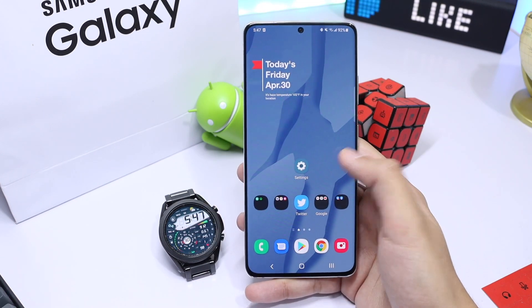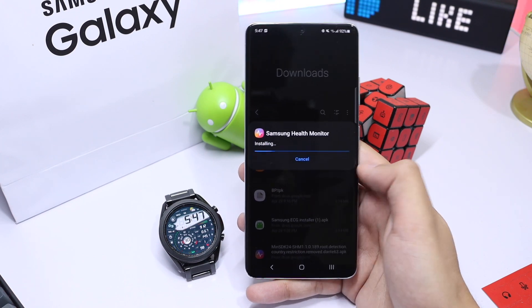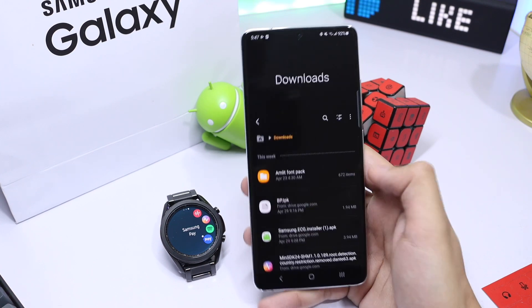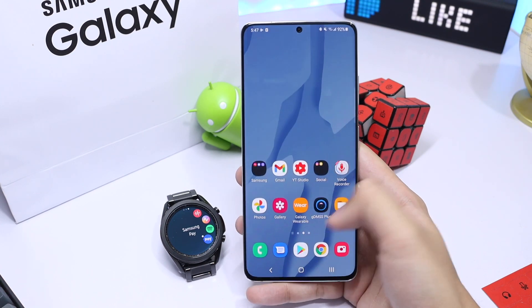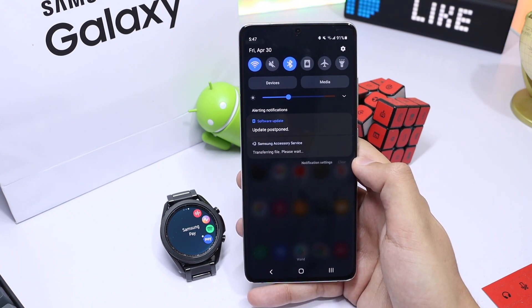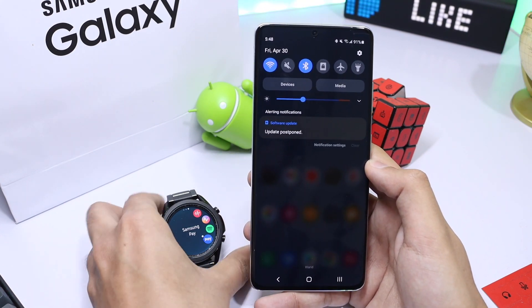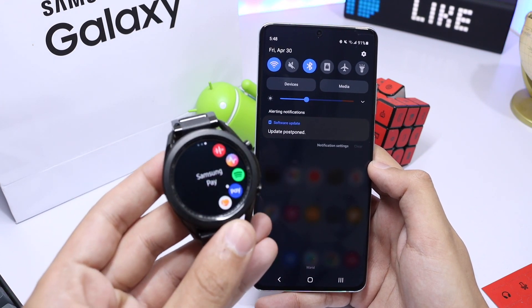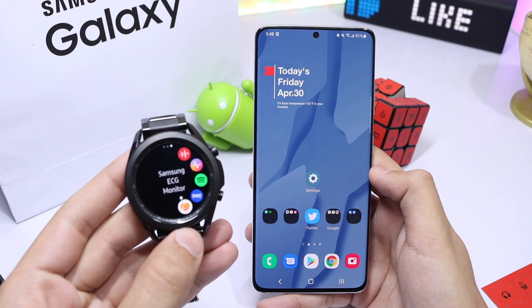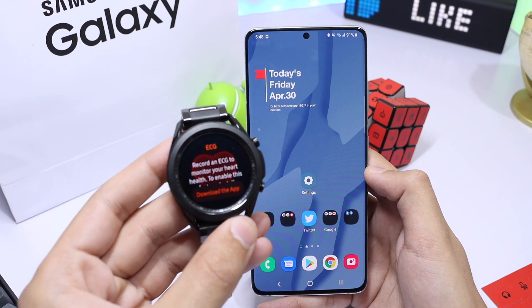Now go to your Downloads folder which has the downloaded files. First, install the modified Samsung Health Monitor app, and secondly install the ECG installer TPK. You will also see a notification at the top saying 'Transferring file, please wait,' which means your file is being transferred from phone to watch. After some time the ECG app will be available on your Galaxy Watch. Open it up, follow the on-screen instructions, wear the watch, and take an ECG reading that you can also share with your doctor as a PDF.